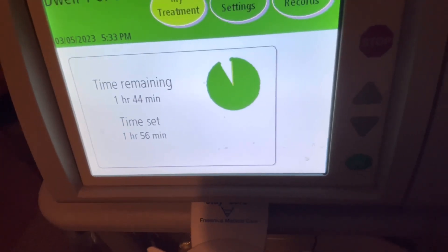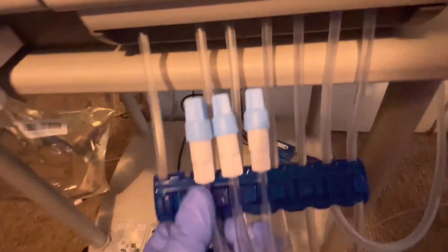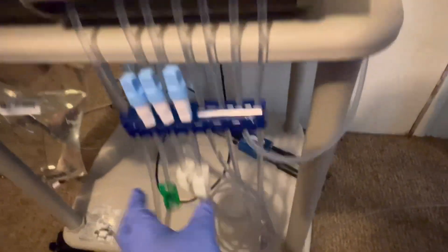It depends on the patient — in his case he has five exchanges. This is how it looks: this line here is the drain line.